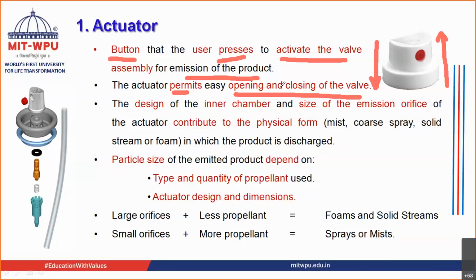Now the design of the valve from inside, and the size of the orifice that is over here, both decide the physical form.